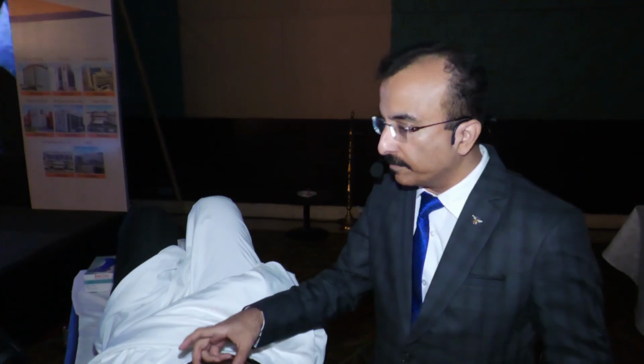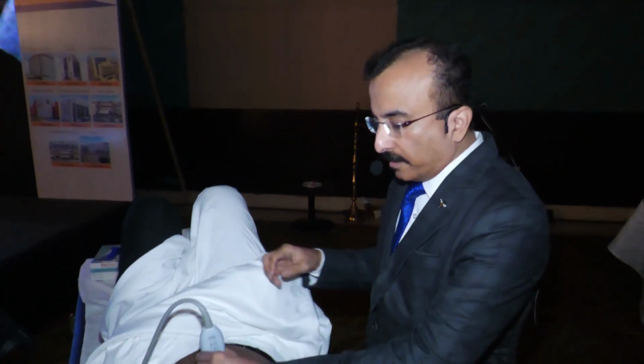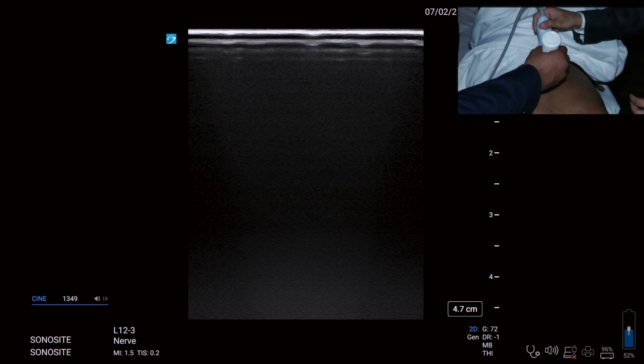So just we were continuing with the rectus sheath. Can I have the linear probe? So I'll give you some of the tips and tricks. Okay. So preserve that twin track appearance and the entry. I can really unfreeze.